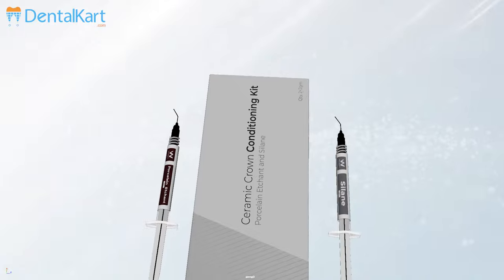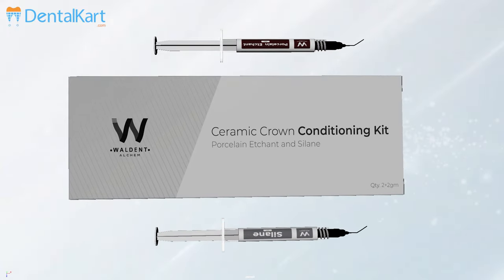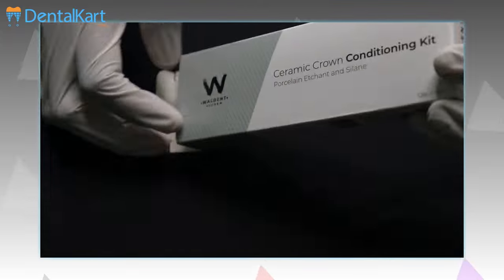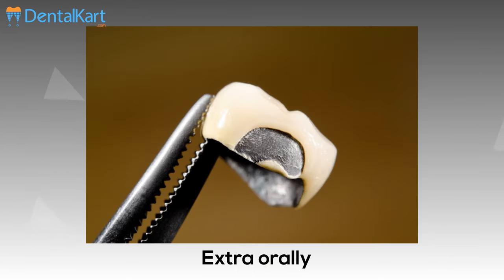The kit also includes a silane primer, which is a single-component coupling agent used after hydrofluoric acid etching to prepare the surface for bonding resin. This kit can be used both intra-orally and extra-orally.